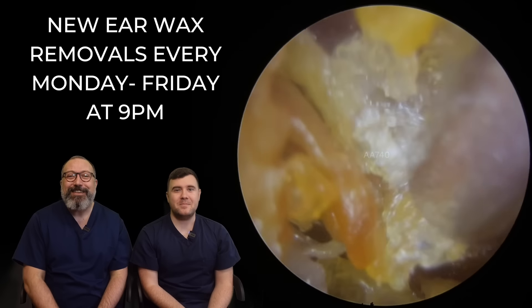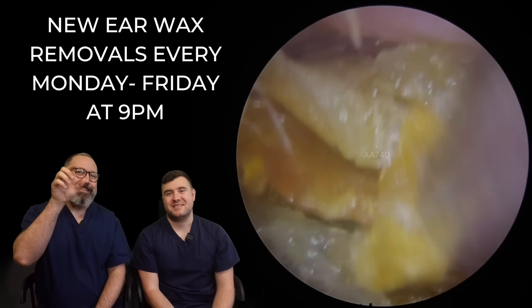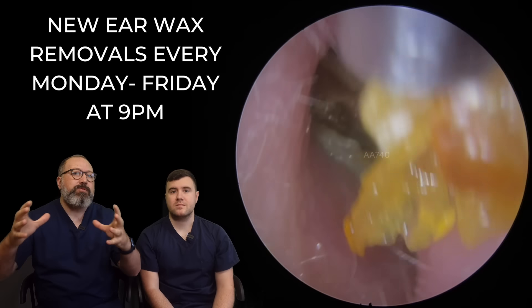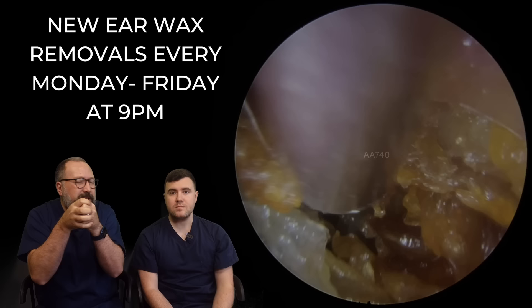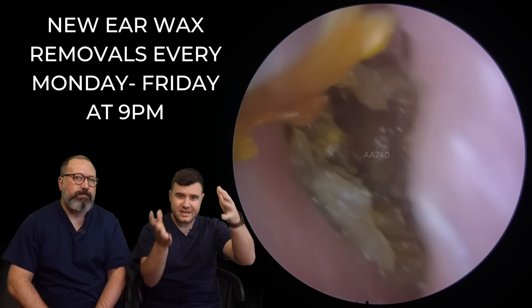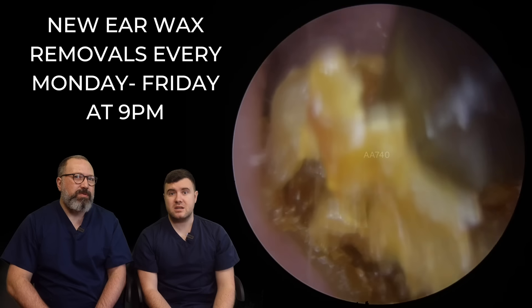So we go back to the ear canal. You can see now we've got — well, we were talking about these layers of skin inside the ear canal. What you can see here is a really classic look where you get these sort of layered buildup. We get that really soft under layer and slightly harder layers as we get to the middle ones; these are the oldest bits of skin. Tough old layers on the outside there, but look how it peels. You can see it's like darker in the center — the harder material — and then you've got that newer, whiter, fresher skin on the outer edge, which is just what's building up and causing this issue with this particular patient.